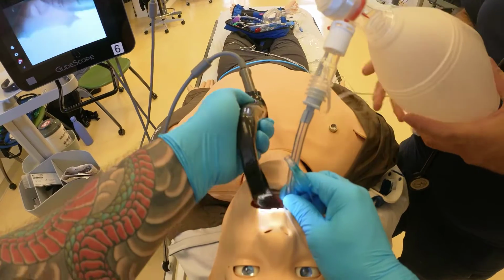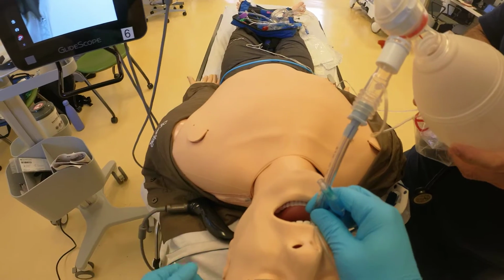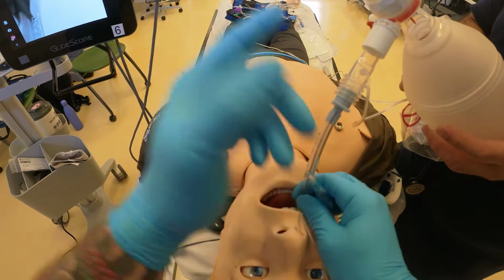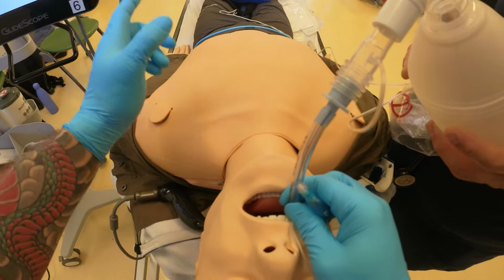And we could take this out, right? And you see obviously positive lung sounds, right? And as I said, I saw it go through the vocal cords. End tidal CO2 35-45. Pulse ox is about 95-100%. And I auscultate, very important, mid-axillary.